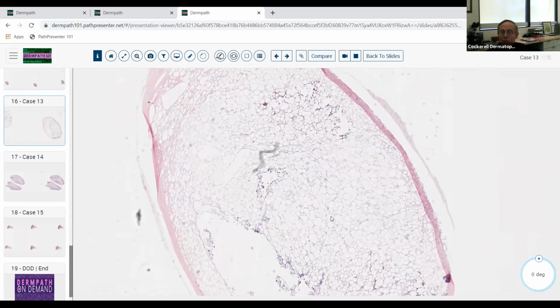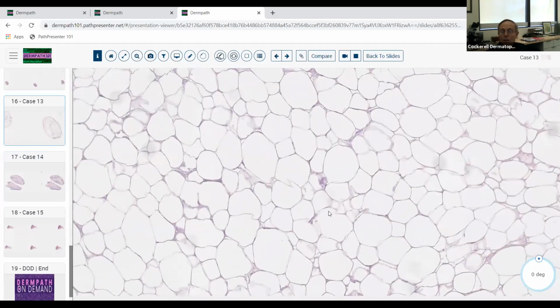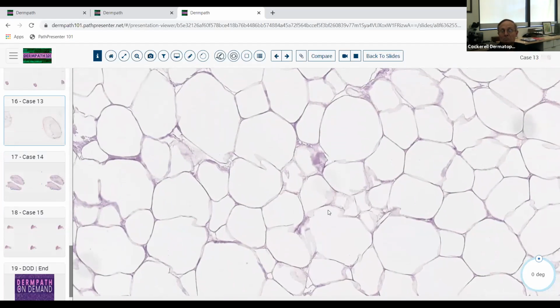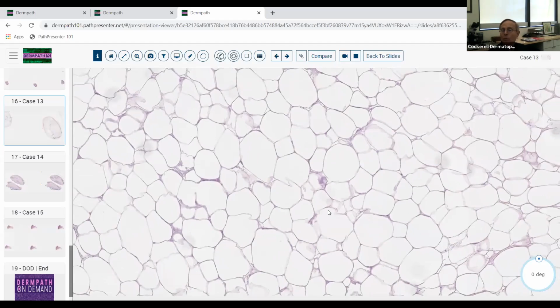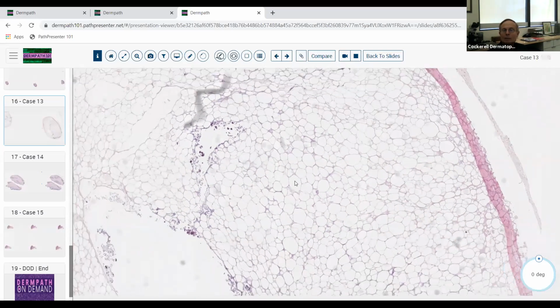What kind of differentiation is it exhibiting? It's got fat differentiation. Okay, so what's the diagnosis? Lipoma, right? So benign neoplasm of fat equals lipoma. 2 + 2 = 4. Nothing to worry about there. You don't have to even think about it twice.